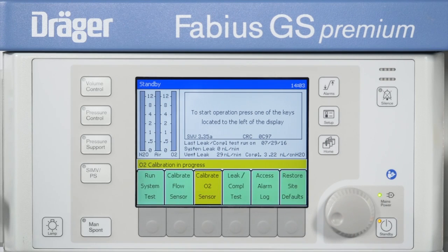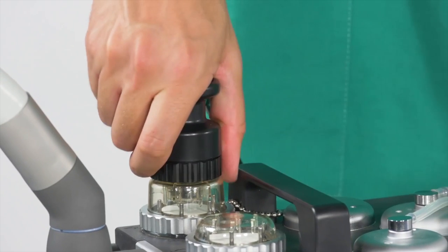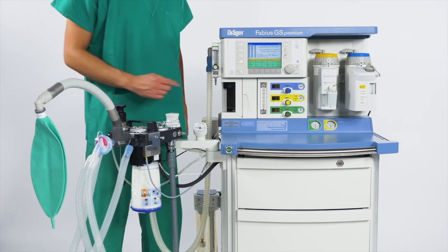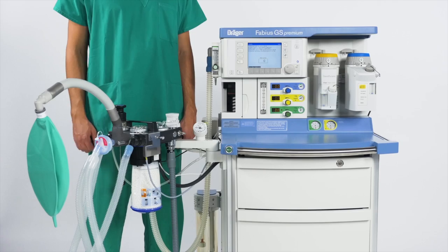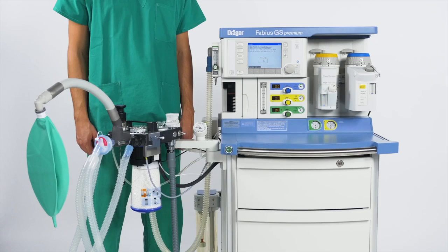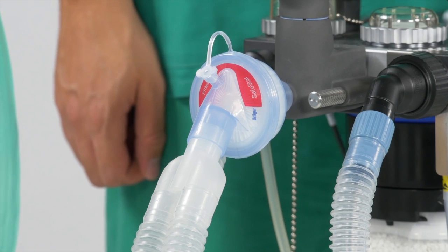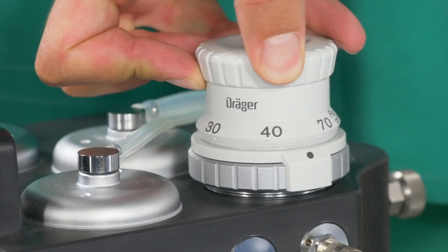Excessive pressure can lead to a significant increase in tidal volume, which can lead to volutrauma, or, after an adequate and safe pressure is set, the tidal volume becomes too low for the patient's ideal body weight, leading to increased dead space ventilation, and the opposite occurs. The situation eventually led to ventilation failure. The volume delivered may vary depending on the patient's own breathing capacity, chest compliance, airway resistance, and even other ventilator parameters such as inspiratory/expiratory ratio and rise time.